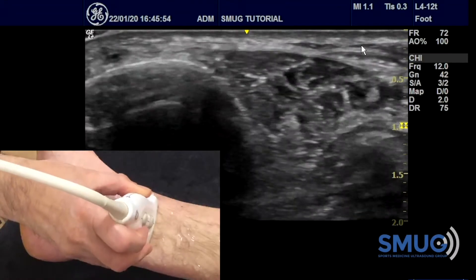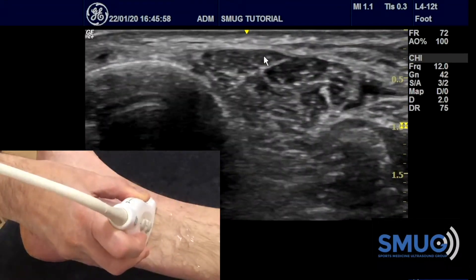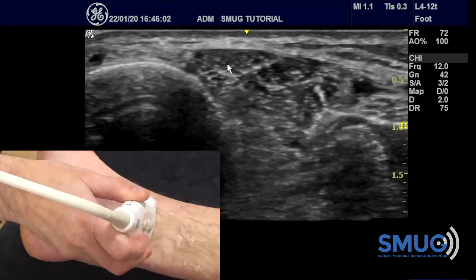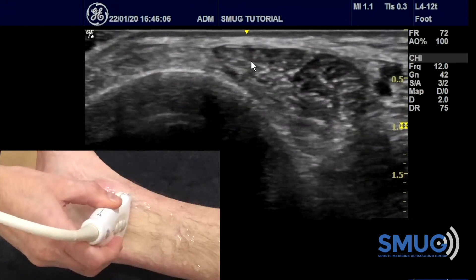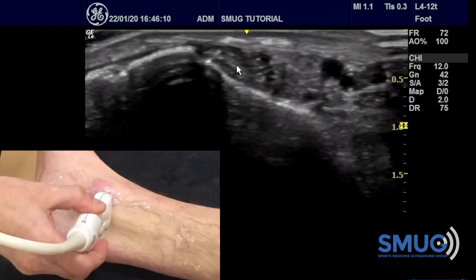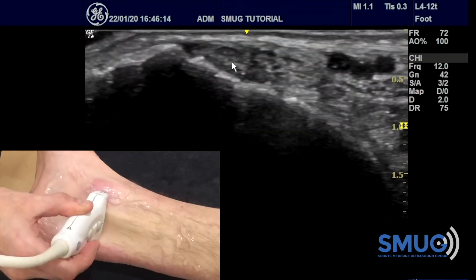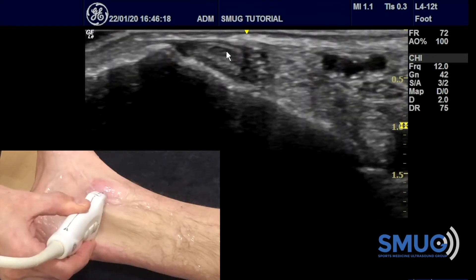To do that, we start above the ankle about five centimeters, where we first identify the tibialis posterior — a big tendon on the posterior side of the tibia. We follow that tendon straight down until we see a concave groove where this tendon finds its place. That's our landmark, and once we find it, we stop there.